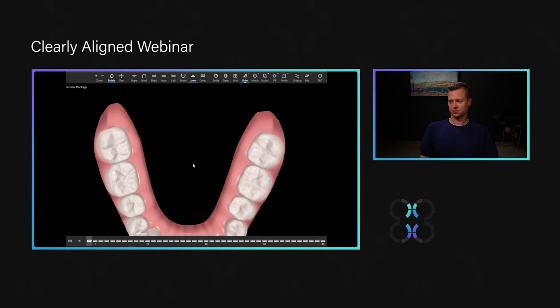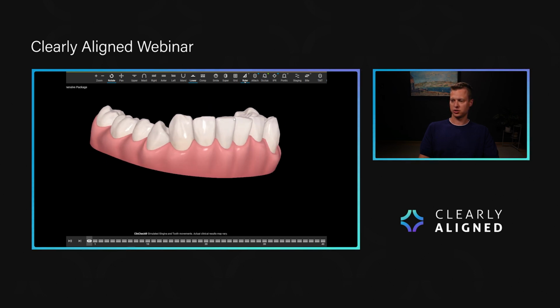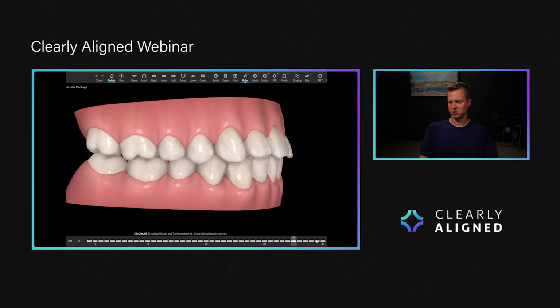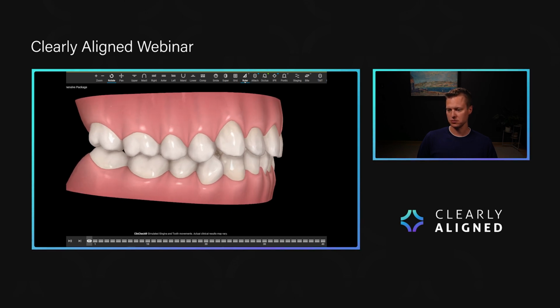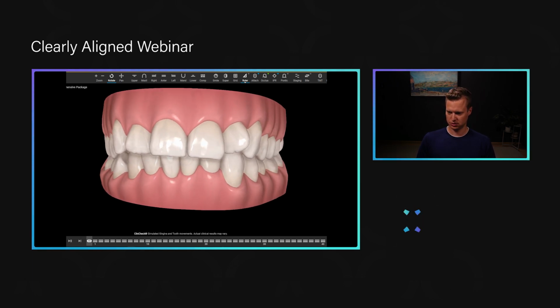Lateral incisor. Lower first premolar. Those are the teeth that have the biggest movements that are happening, where the roots of the teeth are also going to have to move the most. And so those are the teeth that we should consider having particular attachments on them that might be different that we're adjusting. So I'm going to say here it's going to be the 4, 4. We're going to put a vertical. Now we might also want to have that button cut out too. But I'll show you how we make this adjustment in a second. So 4, 4 vertical. And then on the upper lateral incisor, that's the 2, 2 sash.